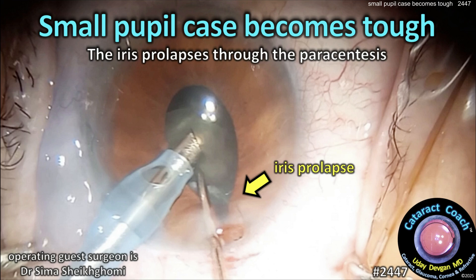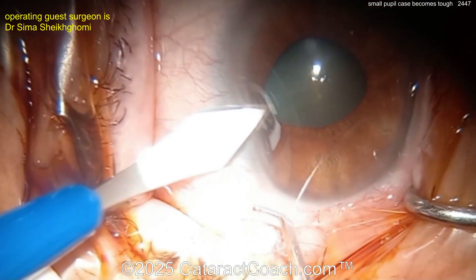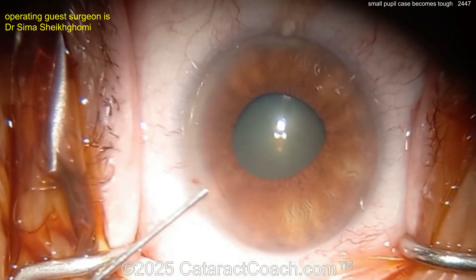From cataractcoach.com: a small pupil case becomes tough when the iris prolapses through the paracentesis. You know it's going to be a tough case. Let's watch this case together. Now making an incision here — looks like a paracentesis being made with the keratome.